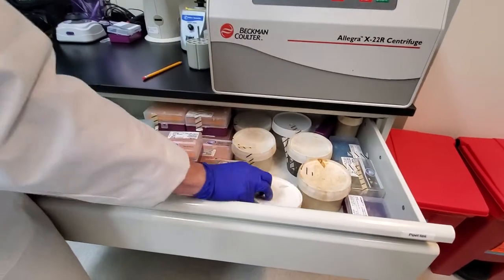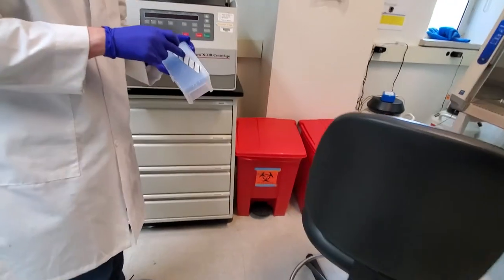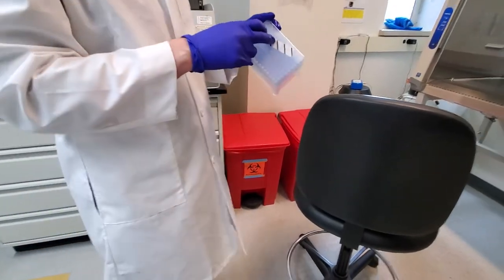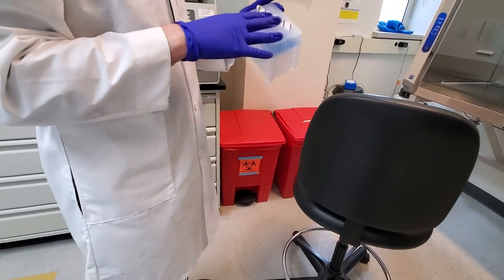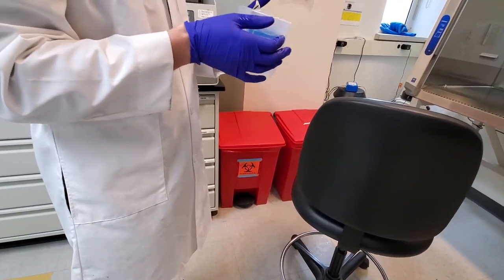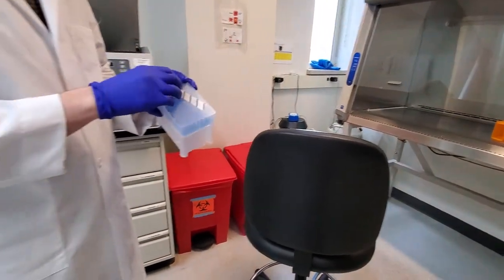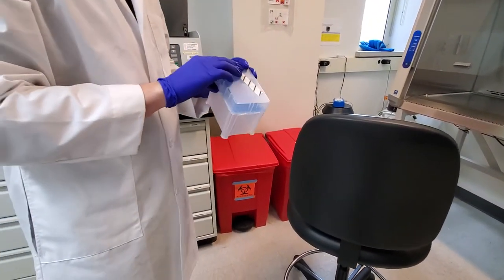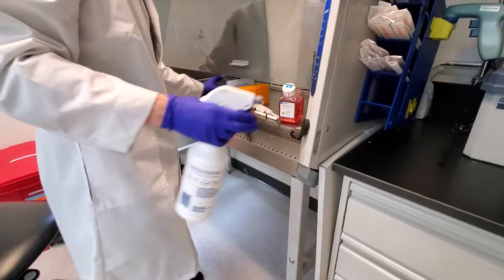In general, once they're out of the sterilizer, the autoclave tape will turn black. I like to keep this autoclave tape on anything I'm keeping sterile, just so I know. And if I take this out and use the pipette tips out of the main lab, I take the tape off just so I know they're no longer sterile. Sterile ones, only open up inside the hood, right?